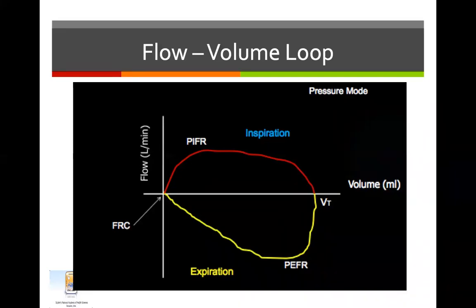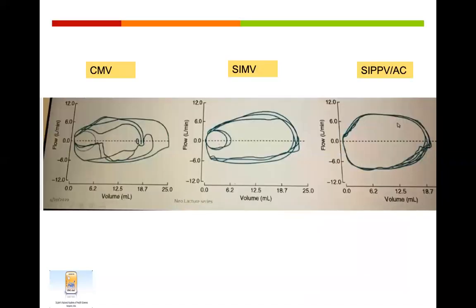Now, what will you look for in this? Again, we want to know which mode of ventilation we are in. Same, synchronization is the only thing you have to see here. Again, in the CMV, the baby is breathing on his own and the ventilator is giving its own. So this will look something like that.